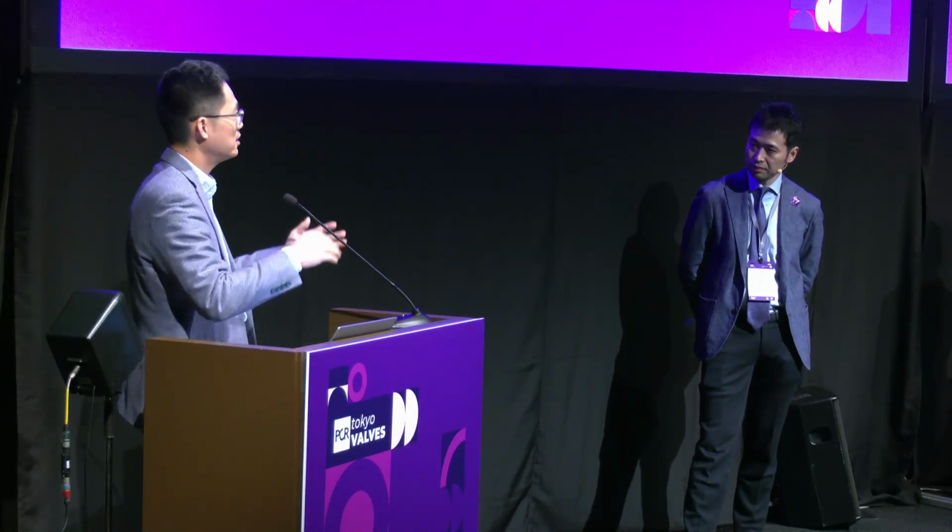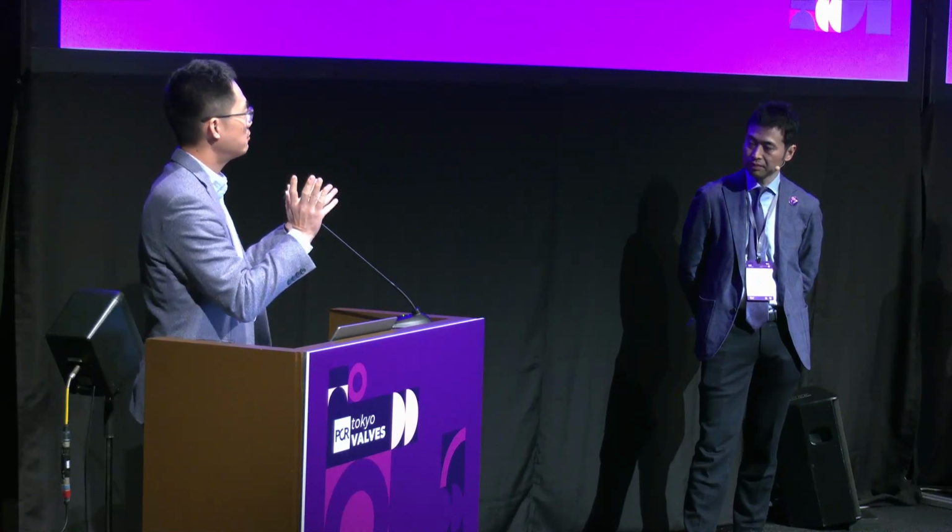And just to echo, Paul has already made a very good point. When you open the clip, because the AP diameter is quite short at the commissure, both arms already exceed both annuli. So whatever you have on your clip, you just lower your gripper, and when you cross, you will capture everything. That's what I learned from previous experience. Even with a very short clip, if you get the right position at the commissure, you will capture everything.